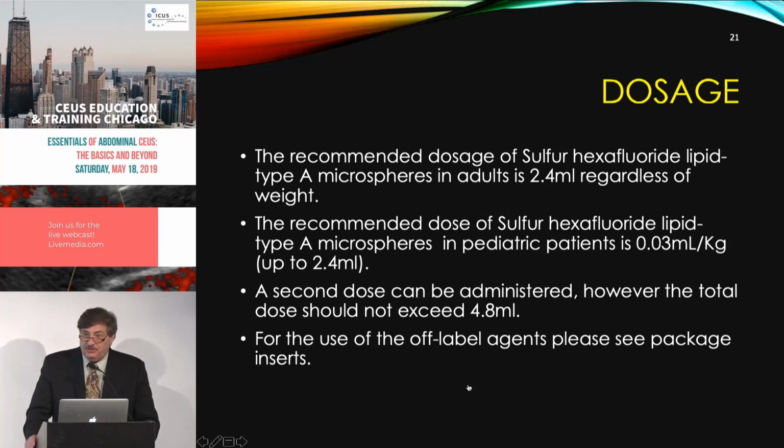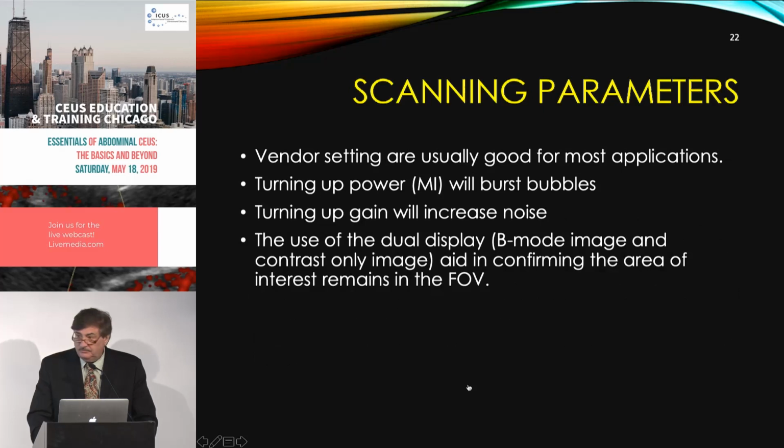And in terms of how much can be administered, again, package dose usually says 2 doses, but you should feel safe if you really need, from a clinical standpoint, to do more. So when we do RFAs, and we do multiple injections to make sure at the time we're doing the RFA that we've got the tumor, we don't care that we use 2 vials if we have to. And again, all these drug companies have tested this at 20 or 30 times the doses you're giving and never had any adverse events.